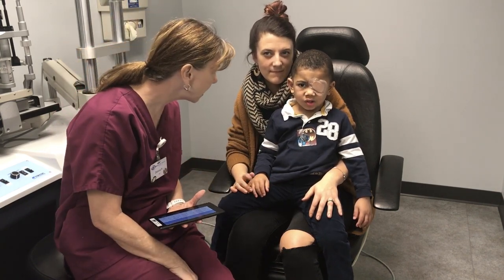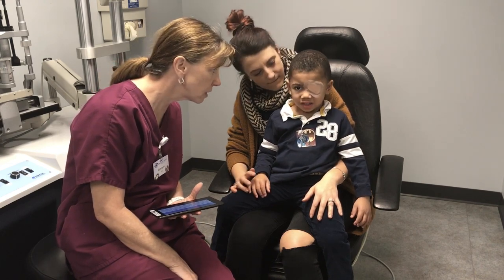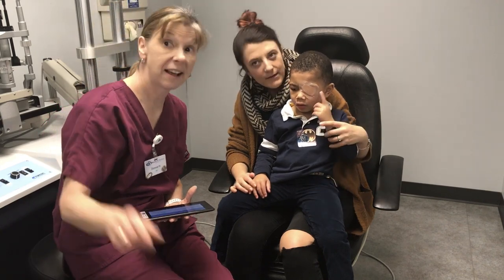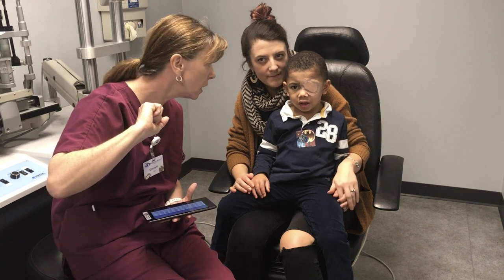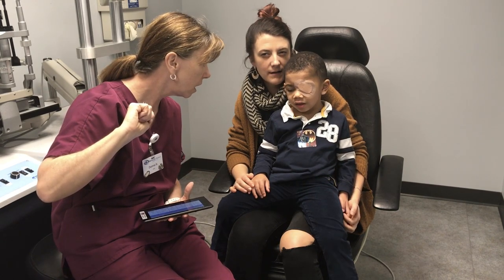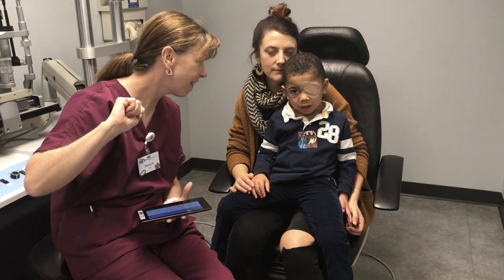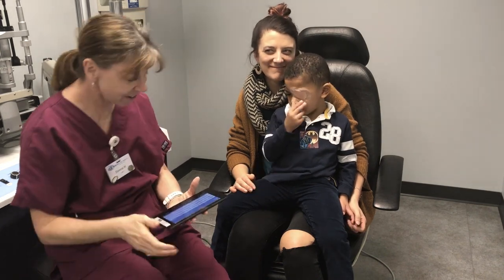Oh, how about those guys? I think the first one looks like a Christmas tree. What do you think? After we do this one, we will. Can you see the Christmas tree? Yeah. What's beside the tree? A cake? A cake, you're right. What's the next one? Hand. And a hand. Very good job.